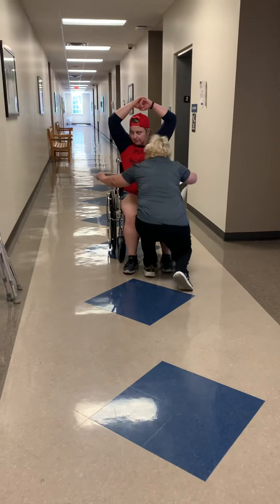I will let you breathe. Is that okay? Tuck that so we don't trip over it. All right. So this cane is going to go in your right hand. I'm going to have you put both of your hands back here on the chair as well as you can with the cane, just like this. I'm going to count to three and then we're going to go ahead and stand up slowly. Oh — we didn't count to three! No, we didn't. You are a fast one.